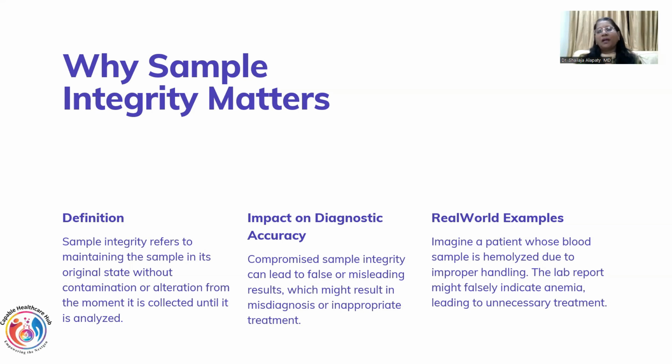That is the crucial part. In biochemistry, we think about hemolysis because we centrifuge it and we can see the lysis. But what happens in hematology? We don't get to see it. And those are the hidden things that will lead to wrong errors.